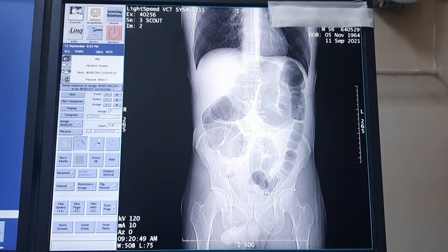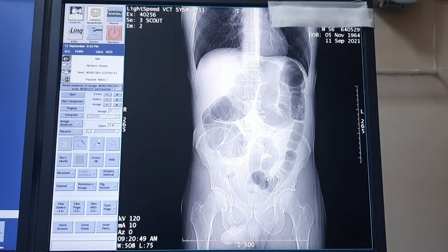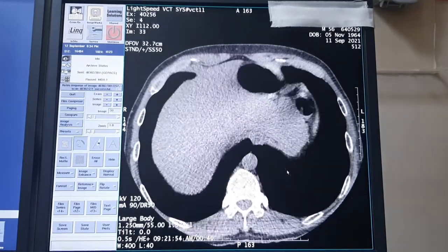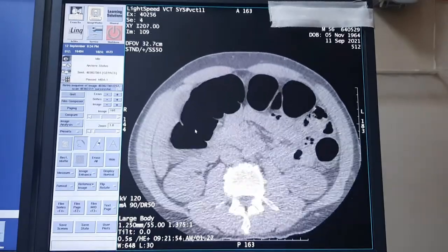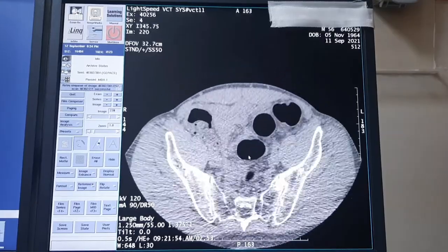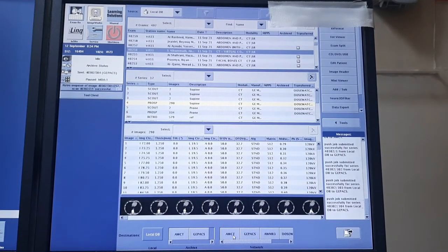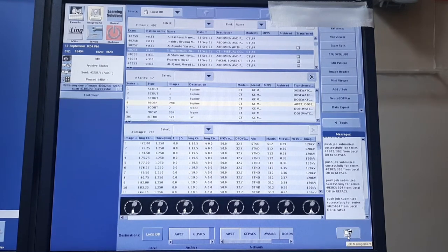The gas is filled. When you have images showing that the gas is filling throughout the entire colon, that is the time you can proceed to scan. You will see the contour of the colon with gas inside all the way to the rectum. After this, you send to the Advantage Workstation to work with the 3D luminal view and make the movie for the colonography.